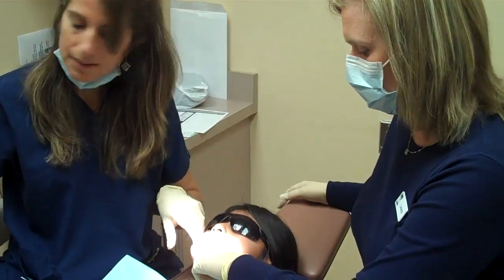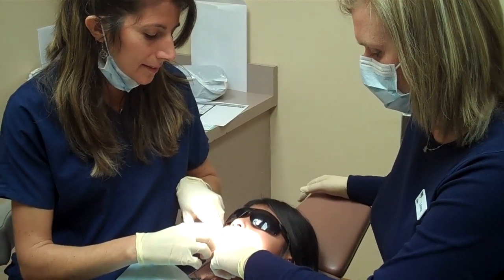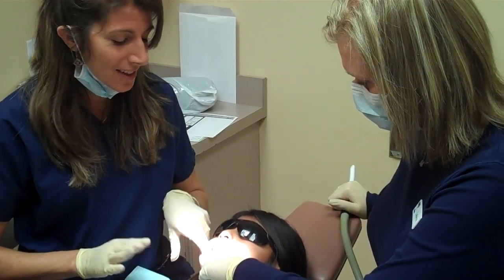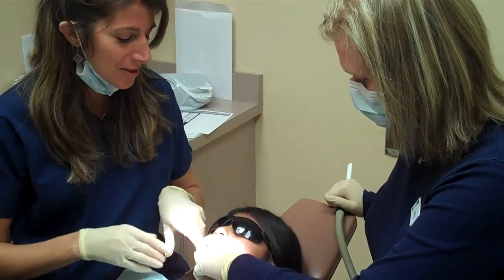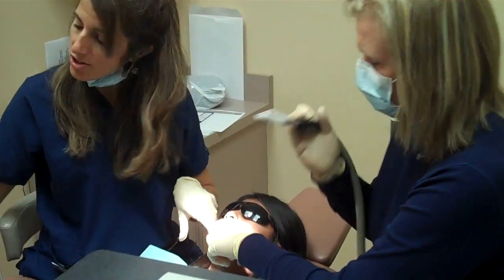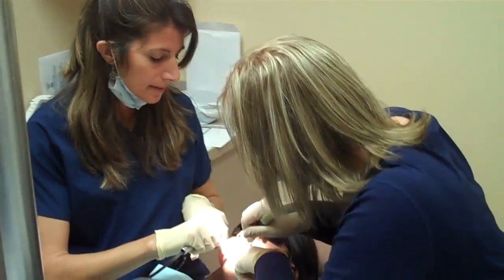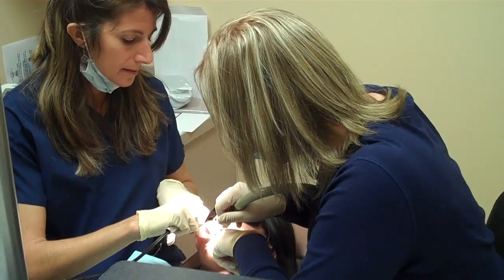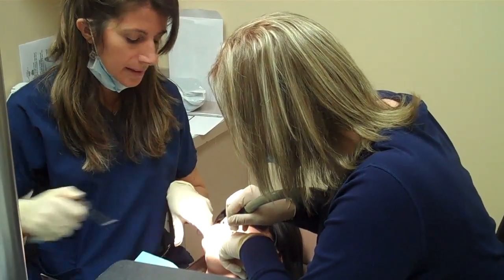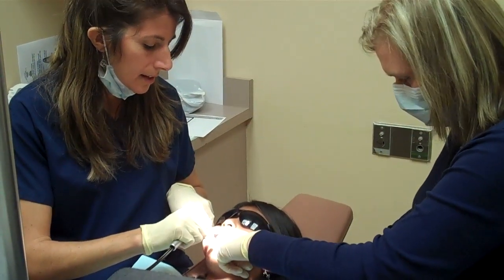And then we just let that sit in for about ten seconds. She is an awesome patient — this is her first day here. She already had her cleaning done and a whole lot of other work, and she was willing to stay for her sealants too. So now Liana's going to bring the super suction in here, and we're going to wash all that gel off of her tooth. And then again, we're going to keep that tooth isolated so we can get it nice and dry.